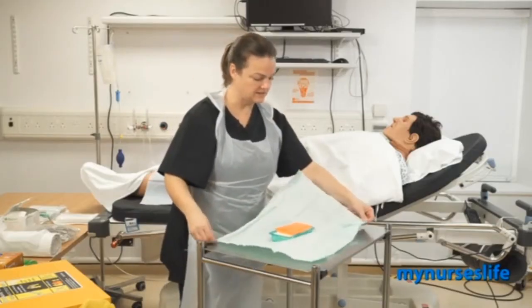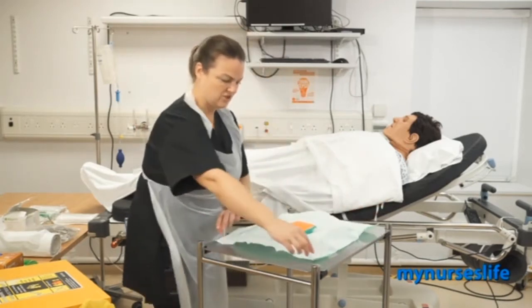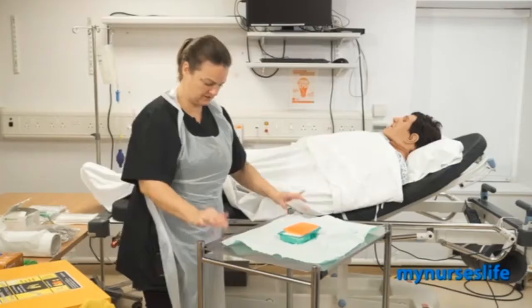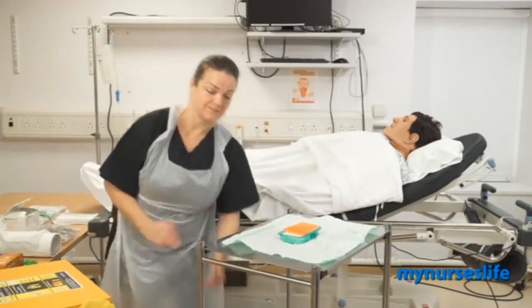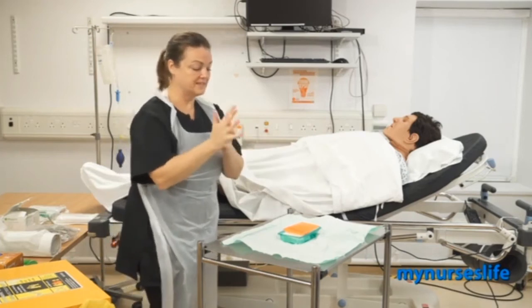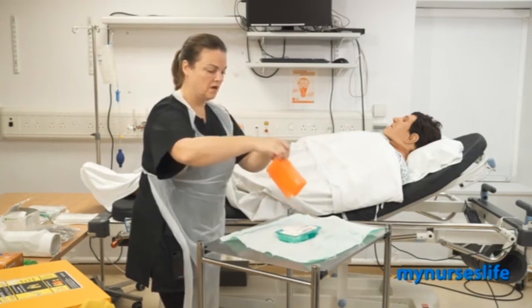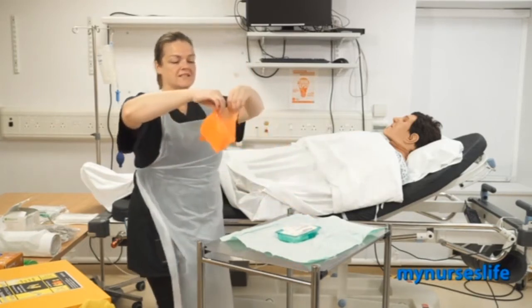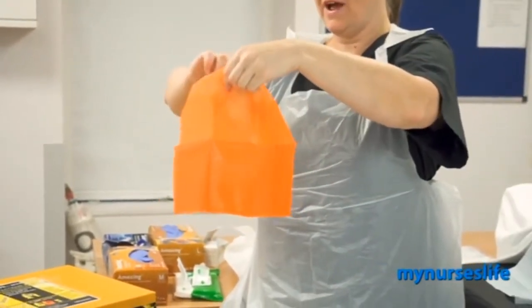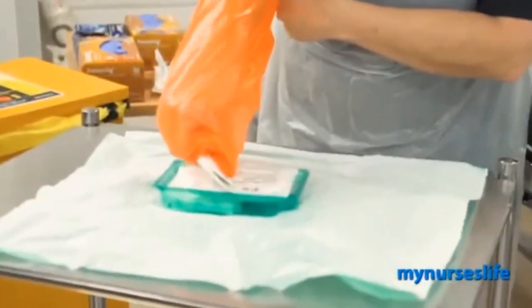Best way to get this to sit flat is actually to pull the edges nearest to each other, and then it should sit nice and flat. So again, I'm going to gel my hands and I'm going to take the bag and use it as a sterile glove to arrange this sterile field, touching only that red line or whatever colour line it is, whatever bag you get, and wear it as a glove like that. I'm going to arrange the sterile field.